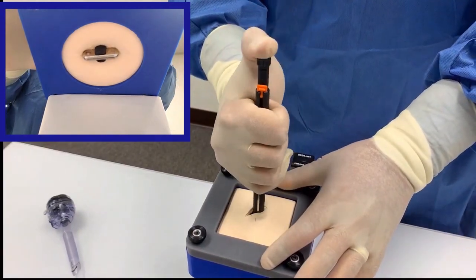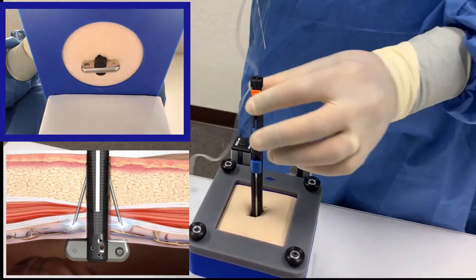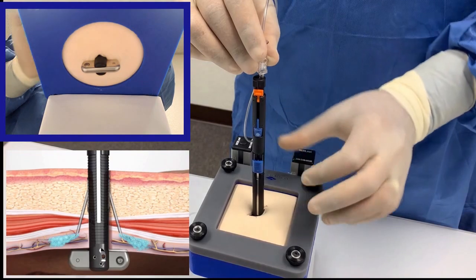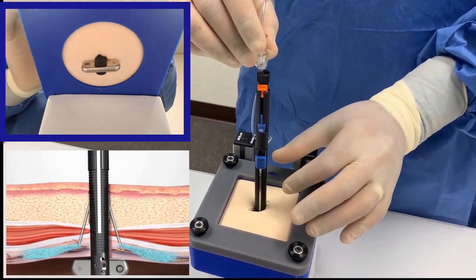Use your thumb to press the plunger to the first click. This advances the needles to the preperitoneal position. Now use the included nerve block needle and tubing to inject local anesthetic. The injection step is optional.